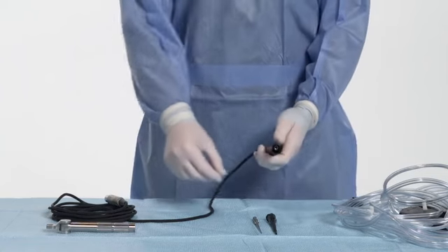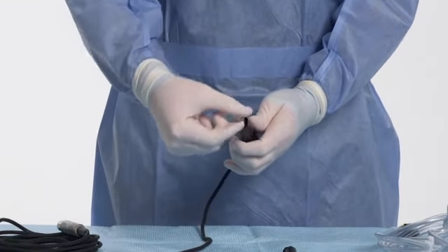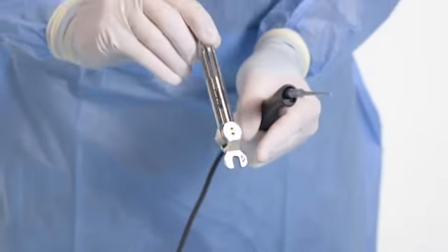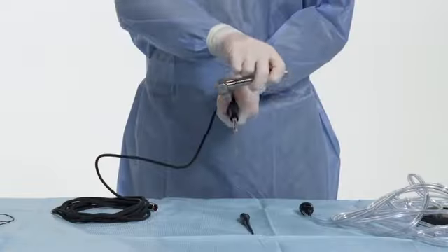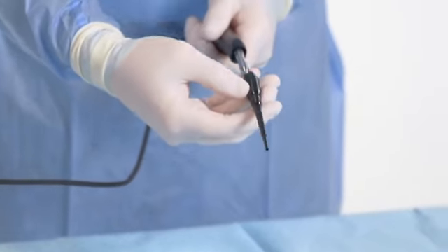Manually thread the tip into the handpiece. Then place the torque wrench with the arrow facing toward the distal tip into the tip notches. Rotate the torque wrench in the direction of the arrow until the torque wrench stops at 90 degrees. Slide the irrigation sleeve over the tip until it clicks into place.